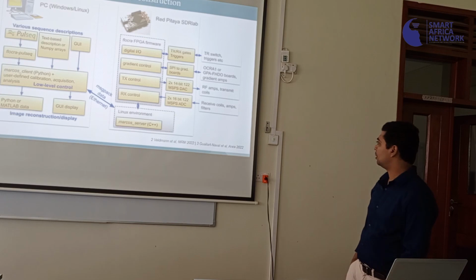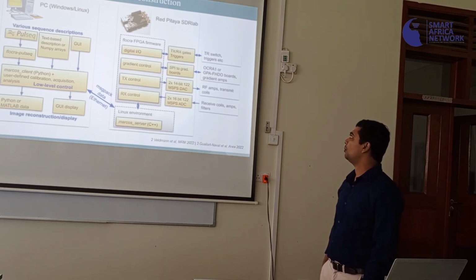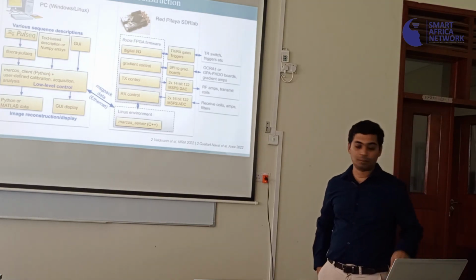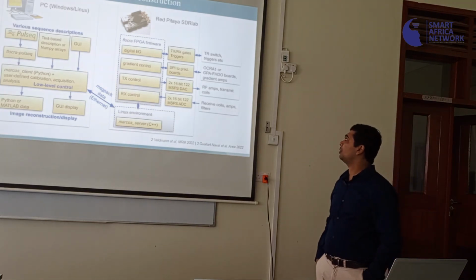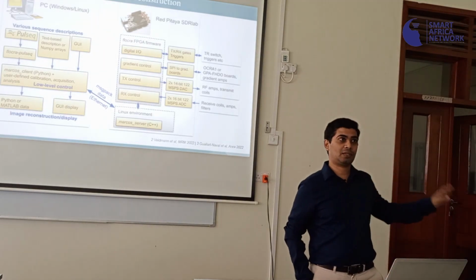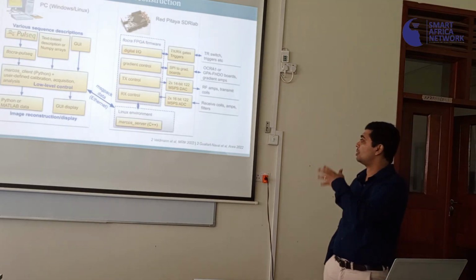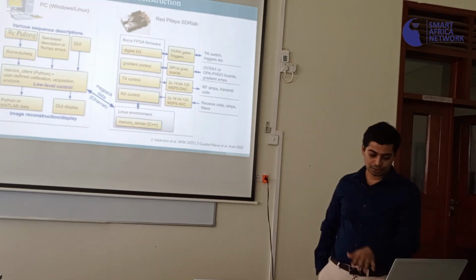Again, this is from a talk this year, talking about how you want to put stuff on a personal computer. I don't know why they stuck to showing the old PC, it could be a laptop. And then the Red Pitaya, which I think the console you might be using right now might be a spectrometer here. But there is another one called SDR Lab from Red Pitaya, which is much cheaper and easier to program, and that's available too.